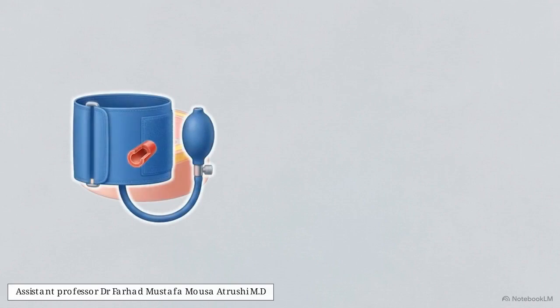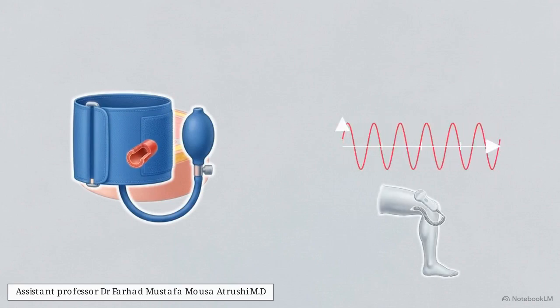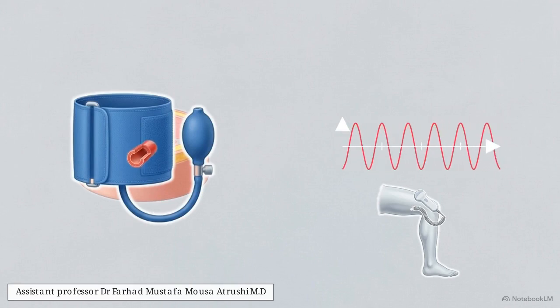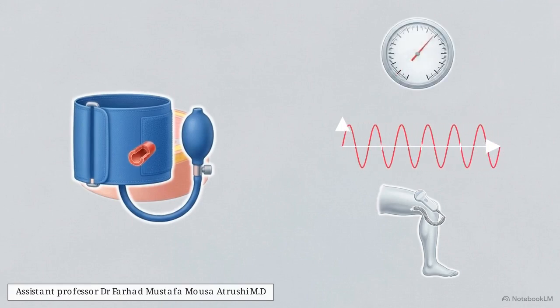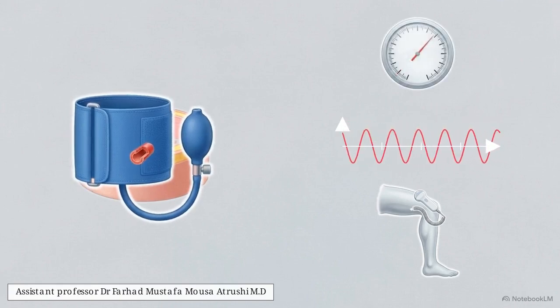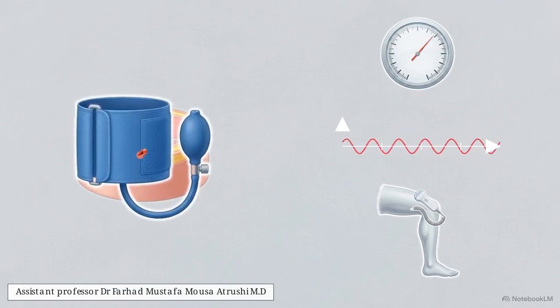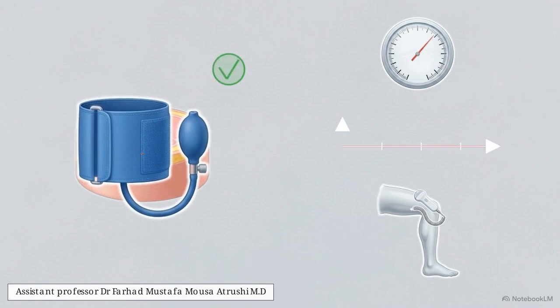We begin with an uninflated pneumatic tourniquet placed securely on the target extremity, surrounding an artery with active pulsatile blood flow. We then place a Doppler stethoscope distal to the pneumatic cuff. This allows us to monitor the active peripheral pulse via both an auditory signal and a visual waveform. As we slowly inflate the pneumatic tourniquet, the increasing inward pressure begins to compress the target artery. During this compression, we look for the exact moment the auditory pulse signal and its corresponding waveform completely flatlines.